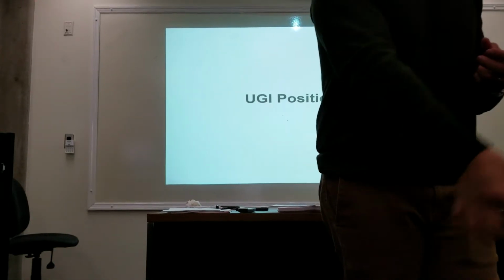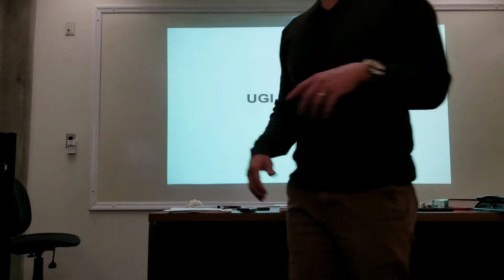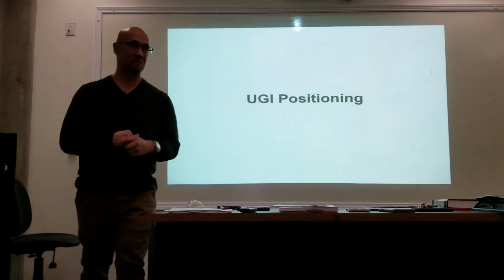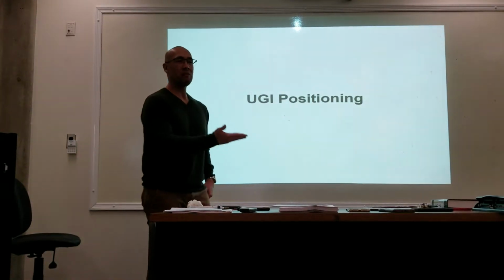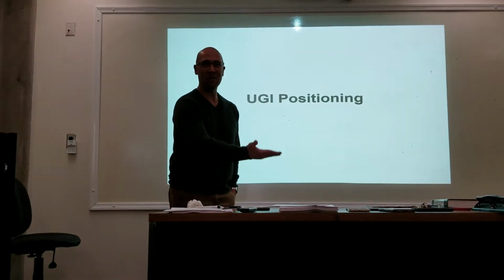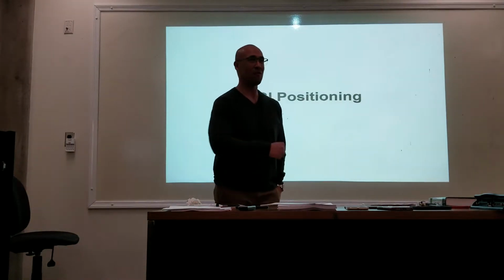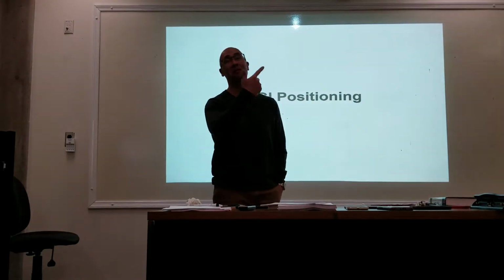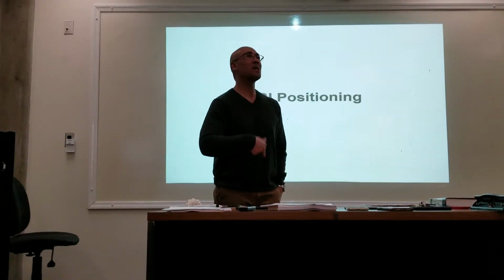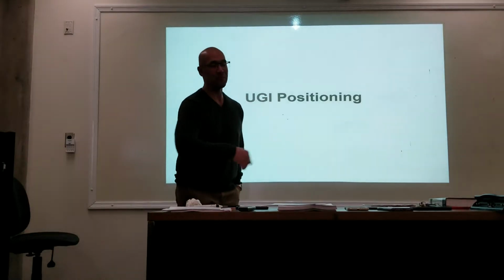So throw the gas crystals, wash it down with the contrast. Now, here's the next step. You're going to have them get on the table. Have them lay on their back for a few seconds. Then on their right side for a few seconds. Then on their belly for a few seconds. And then on their left side. You see what I'm doing? I'm coating up the stomach. So they're going to be rolling around on the table.